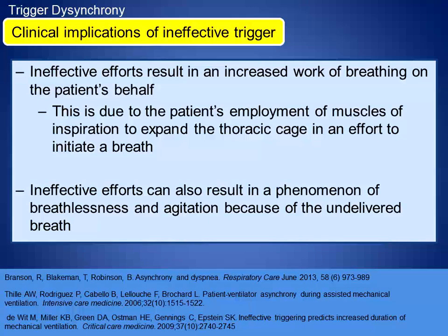There's also what I think you have to appreciate, this phenomenon of breathlessness on behalf of the patient. They're trying to take a breath. Their brain is telling them they're trying to take a breath. Everything about them is trying to do this. However, the machine isn't delivering a breath to them. The patient will tell you at this point a lot of times that they're fanning themselves, "I'm not getting any air," and a lot of times they're exactly right. They're self-diagnosing almost. And how this unravels is that because they feel breathless, they become more anxious and more agitated, and they become more difficult to manage at that point. So those are really the clinical implications of an ineffective trigger.